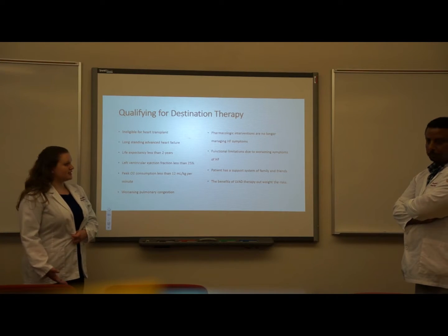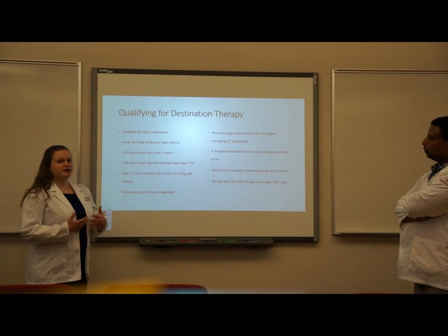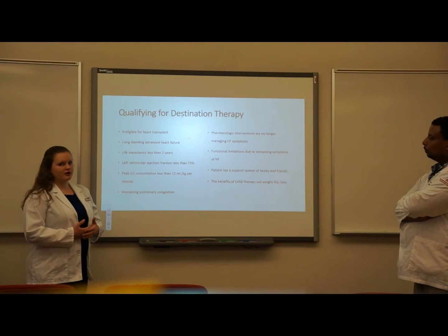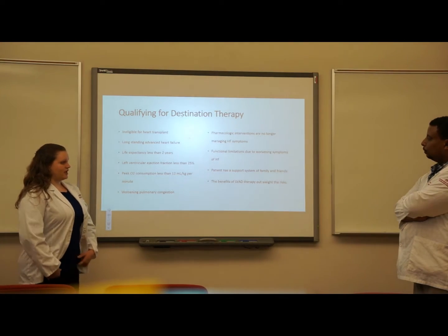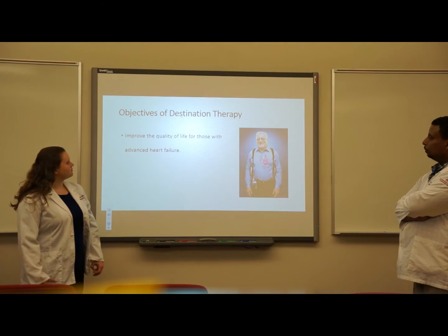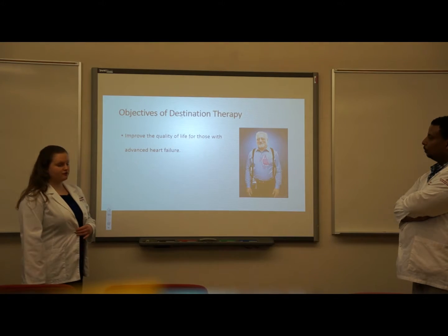They have functional limitations due to worsening symptoms, and it's important that the patient has a good family or friend support system, because going through destination therapy can be very emotionally draining and physically draining. The benefits of the LVAD therapy must outweigh the risks for these patients. The objectives for destination therapy, as described in the video, are to improve the quality of life for those with advanced heart failure.